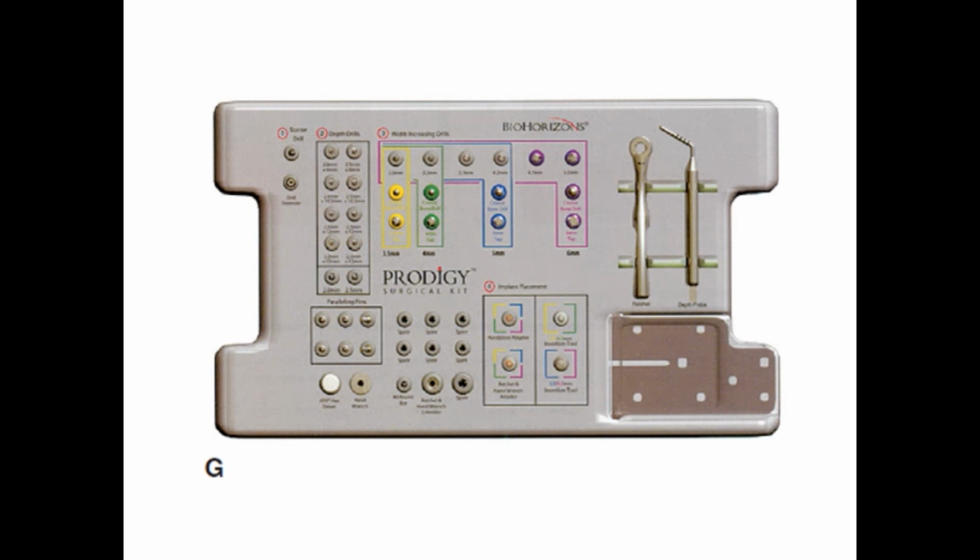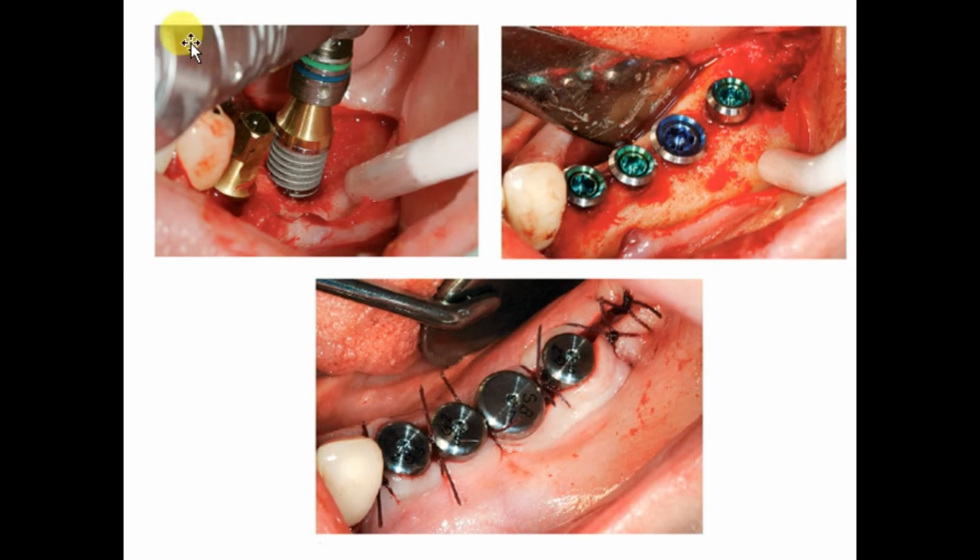Here you can see an implant drill kit with color coding. Most often it identifies the drill sequence and the final diameter related to each implant size. So basically we begin the implant insertion with a starter drill, which is used to create a dimple or notch on the crest of the ridge at the proposed implant site to avoid slippage. Then a pilot drill 2 millimeters in diameter with a predetermined length. After that, sequential drilling is performed until the final drill is used, which is 0.5 millimeters smaller than the implant diameter.